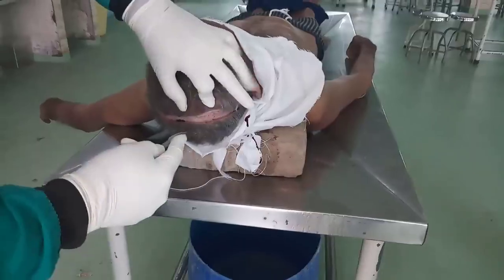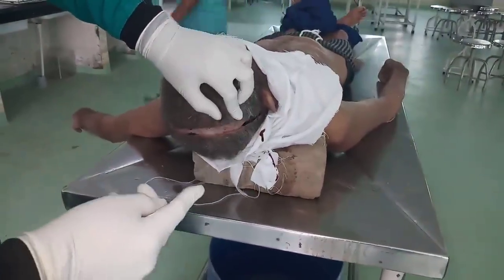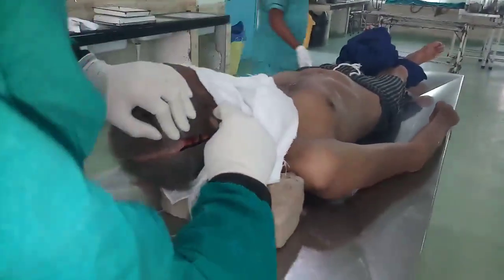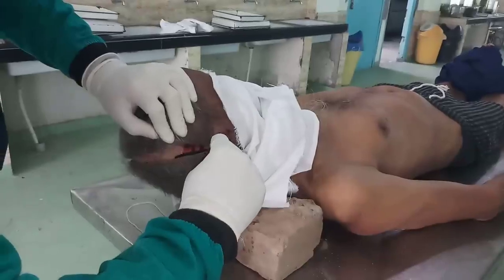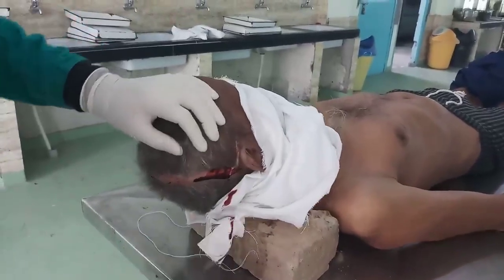Please take care that the hairs are not cut. All the layers of the scalp are cut. This is the first incision. We'll just extend this incision a little bit like this for ease of dissection.